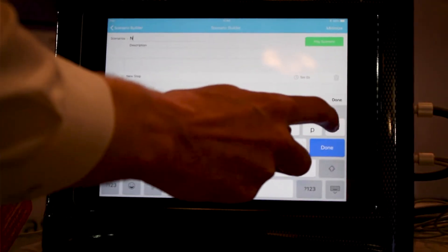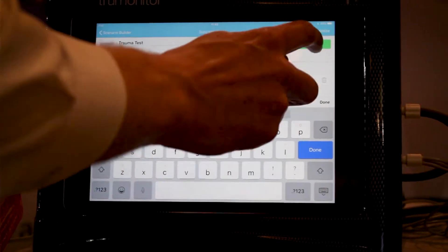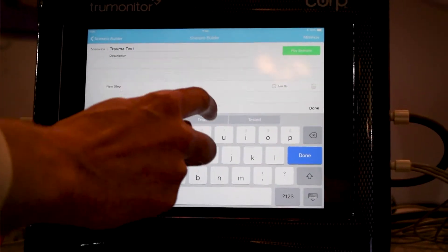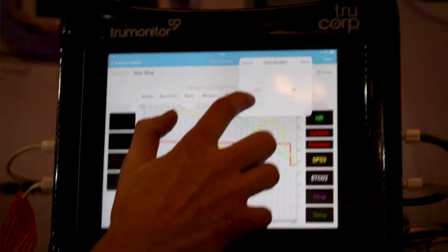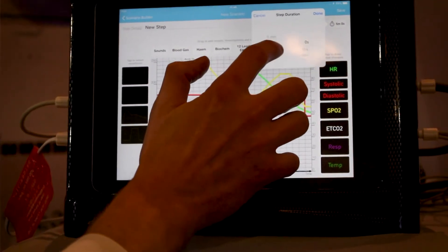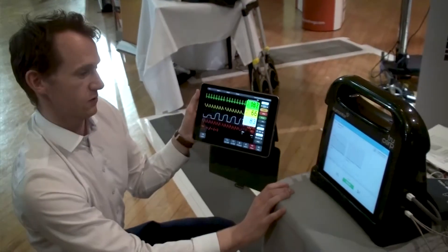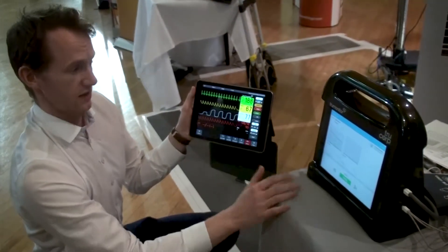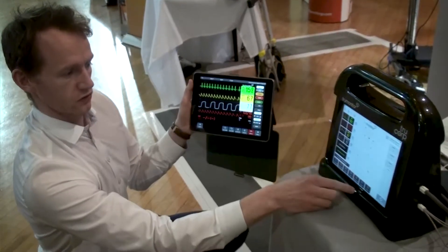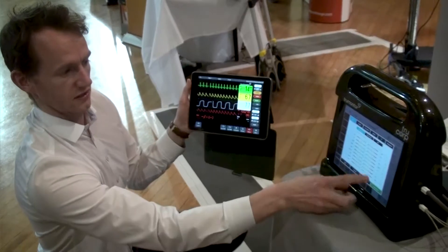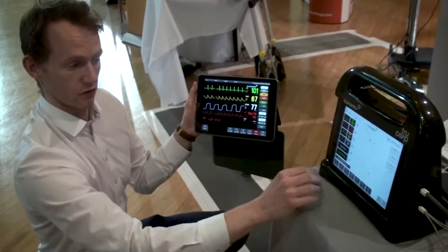You simply build it, save it, and then go to play. Hit prepare, then start, and you can see everything starting to change. It's a very good piece of product when it comes to scenario building. You've also got different types of investigations you can add in, and you can save your own scenarios and transfer them across as well.